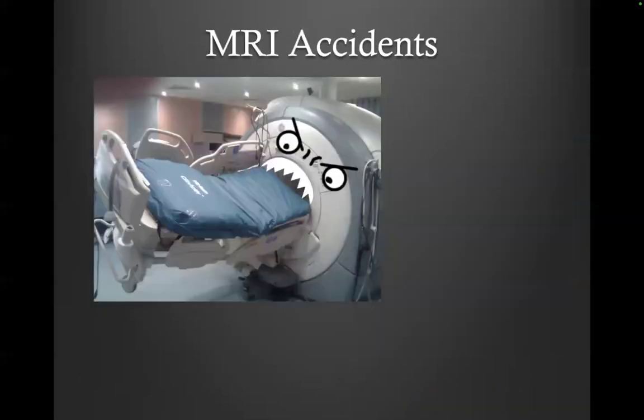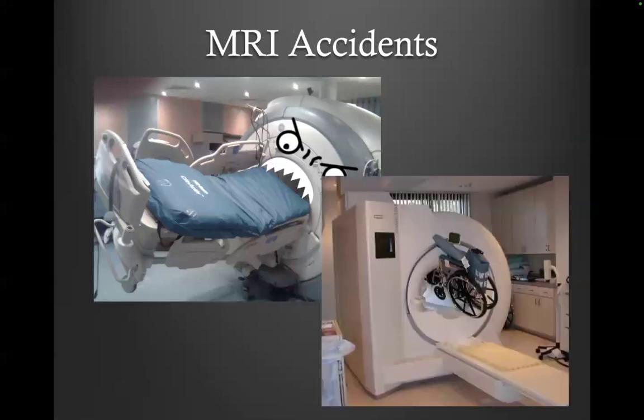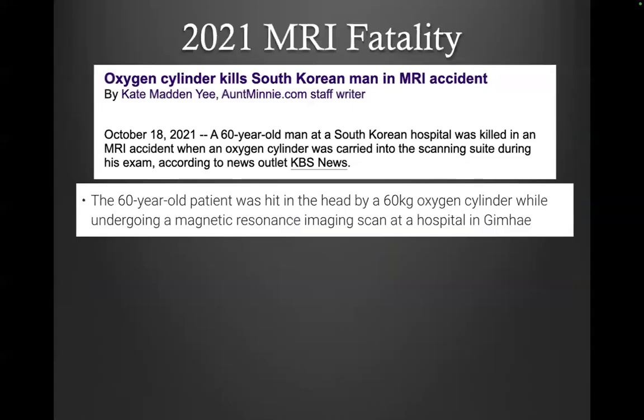And if you Google search MRI accidents, you're going to see all these crazy images. Believe it or not, these accidents still happen all the time. The most recent MRI-related fatality was not too long ago, in 2021, in South Korea.